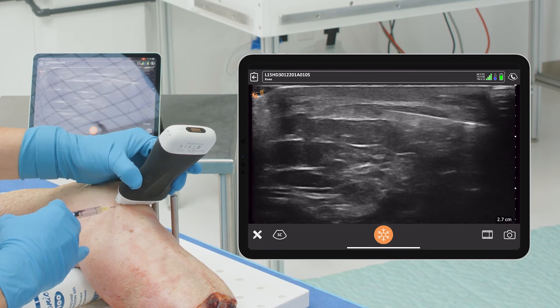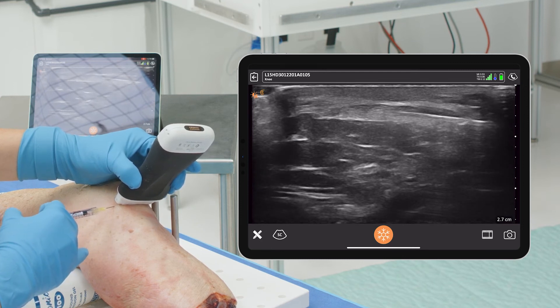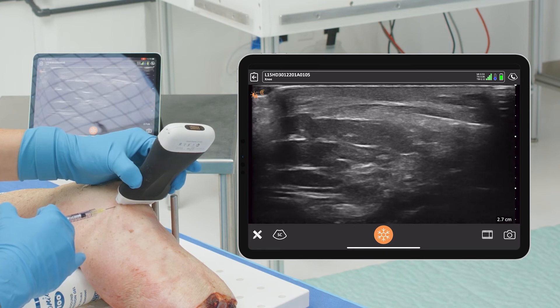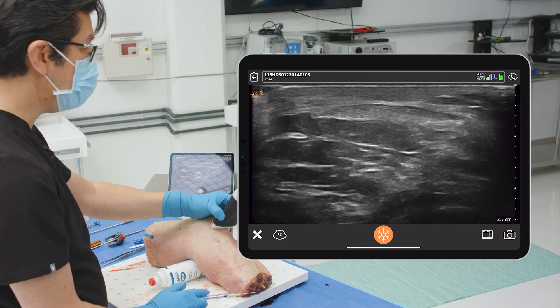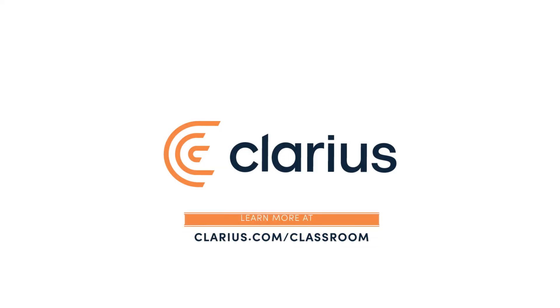This really makes it point-specific — wherever you want to be within the tendon to hit your spot. You can see how easy it is to find, localize, and be point-specific with your biologic for hopeful healing.